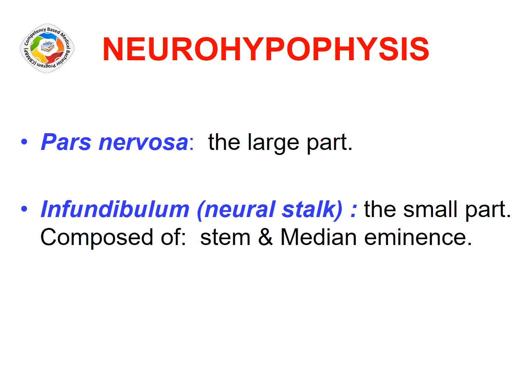Neurohypophysis, or the posterior pituitary. It consists of pars nervosa, the largest part, and the infundibulum, or the neural stalk, the small part which is composed of stem and median eminence.